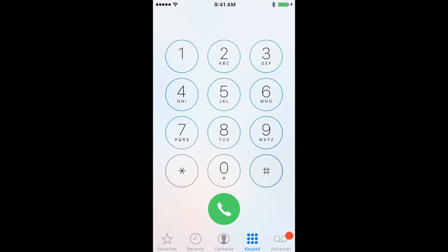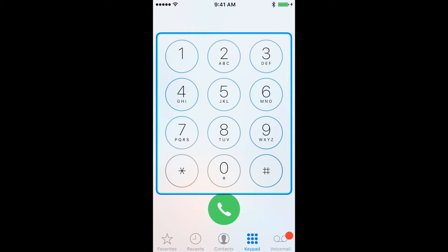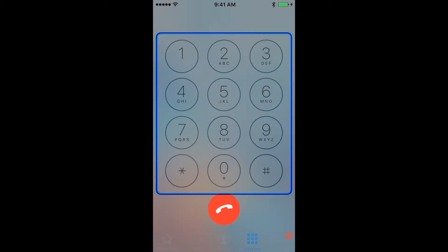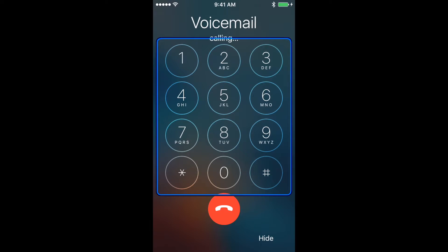To call your voicemail, wait until the scanner highlights the voicemail icon at the bottom of the screen and press your switch once. To access the keypad, press your switch as the scanner highlights the whole keypad. Press your switch once and the scanner will then highlight each row individually.